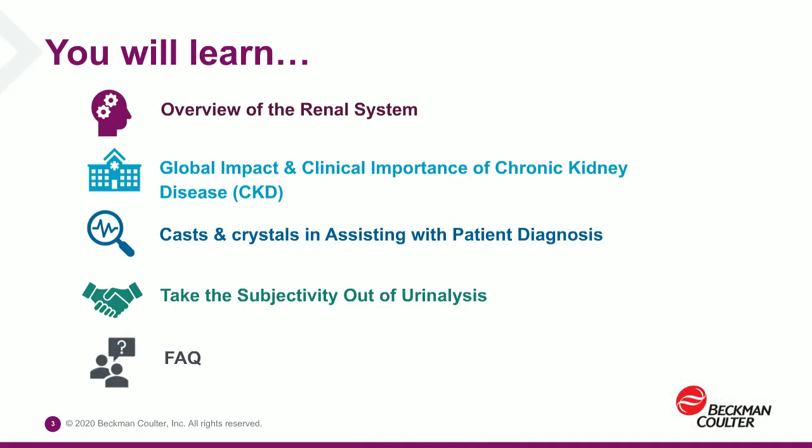Thank you, Dawn, and welcome everyone. During this first part of the webinar, I'll start with a broad overview of the renal system, then highlight the health impact of kidney disease. Next, I'll focus on the presence of casts and crystals in a urinalysis, and finish with the clinical utility of identifying casts and crystals in a urinalysis.